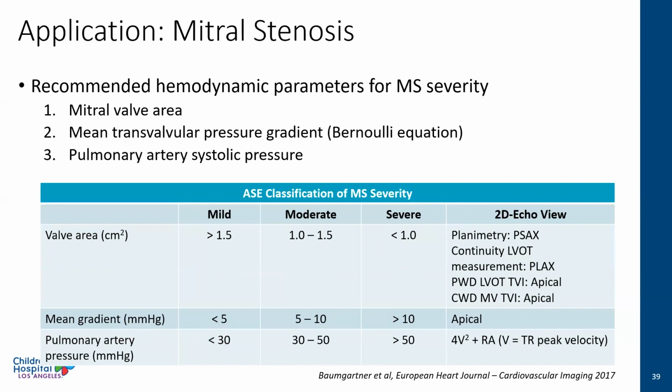And then they have done the same thing for mitral stenosis, where the recommended hemodynamic parameters for measuring mitral stenosis are going to be your mitral valve area, your mean transvalvular pressure gradient, or the Bernoulli equation, and then your pulmonary artery systolic pressure.